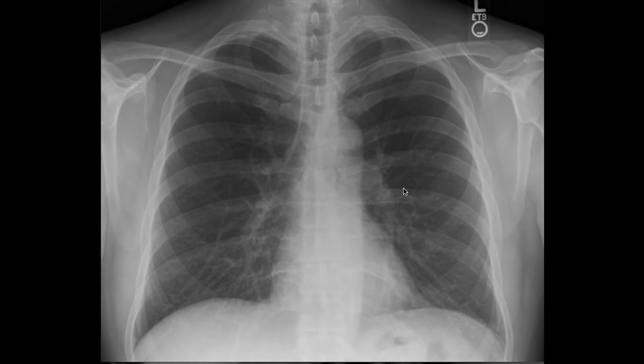When we speak about indications, it means why is the chest X-ray being done. So first of all, and what's really amazing to know is that a simple chest X-ray can give you a huge understanding of the patient well-being. So that's why the first indication when you have a medical checkup or you have a new staff coming to work in a hospital, or you have the medical commission tests when you have expats coming to the country, they usually have a chest X-ray because it gives you an understanding of the overall health of the individual. Now that's the first indication I can recall.